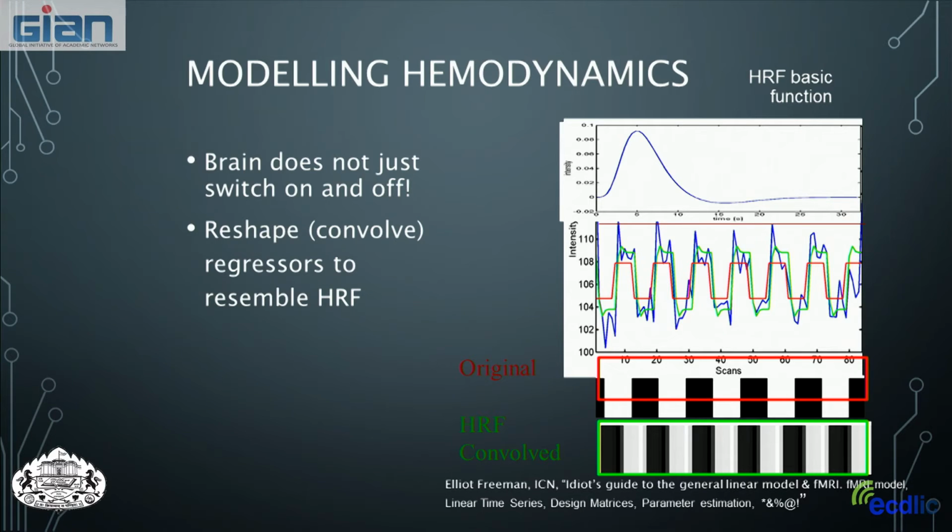But what we have to remember here is this hemodynamic response function is a slow function, okay? So when we do the task, we are not going to assume that the brain is instantaneously changing. We remember that the BOLD signal takes about 6 seconds to peak, and so it has a little bit of delay before it turns on. And so we're going to use that when we model our data. We're going to allow for a little bit of delay between when we have our task and when we assume that we're going to see our function.